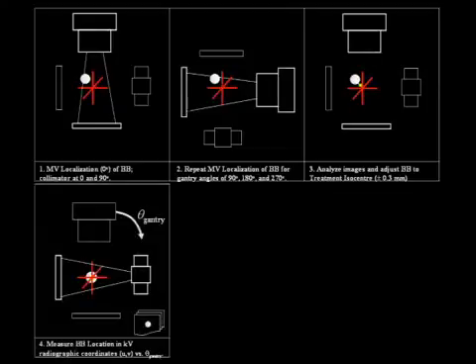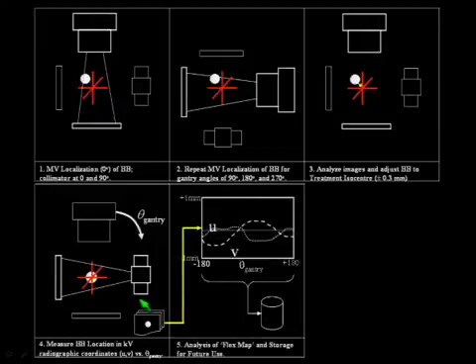And once this is done, we can perform a calibration acquisition for the IGRT system. In this case, this is cone beam CT. The imaging system will then record and define a function which we call a Flexmap that shows the apparent motion of the object on the imager as the components, the arm and flat panel of the device, flex and torque as the gantry rotates around it.